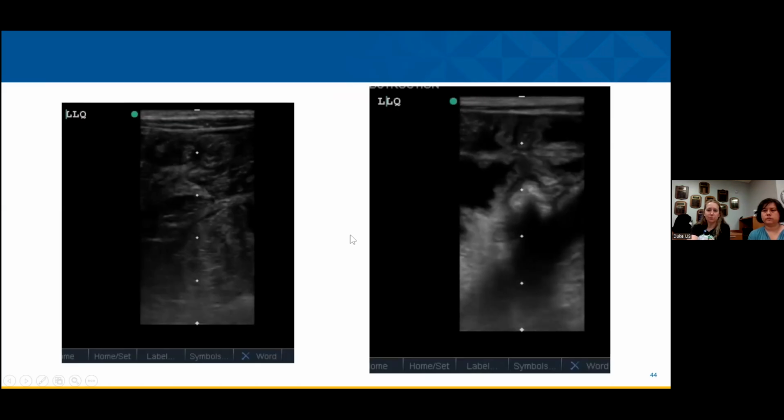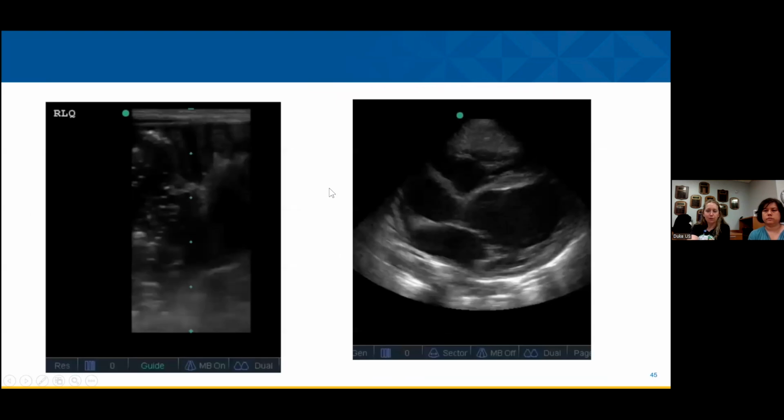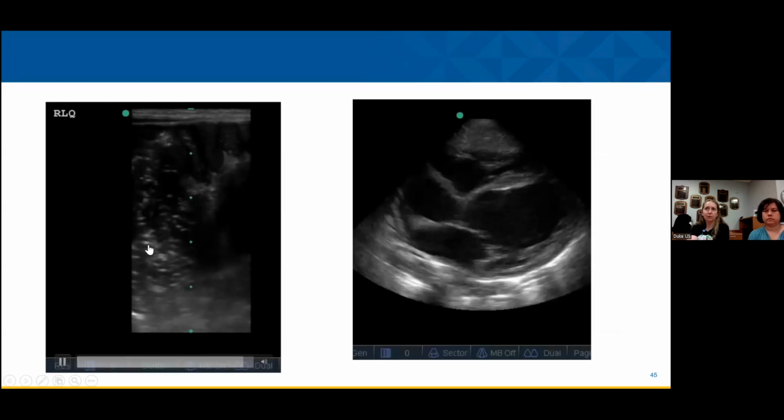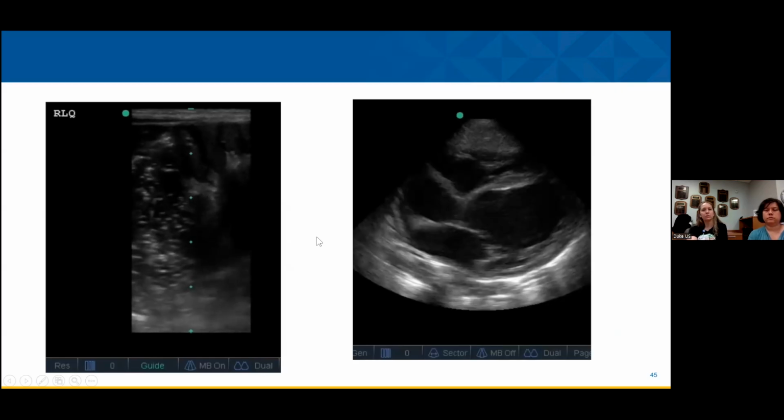So the team was concerned because there was not a lot of movement seen in this patient's bowel, given his history. This might be an example of just the start of that back and forth, or to-and-fro, movement of the contents of the bowel, kind of consistent with an obstruction. So in this patient, we were quite concerned that he had an obstruction, potentially from typhoid.